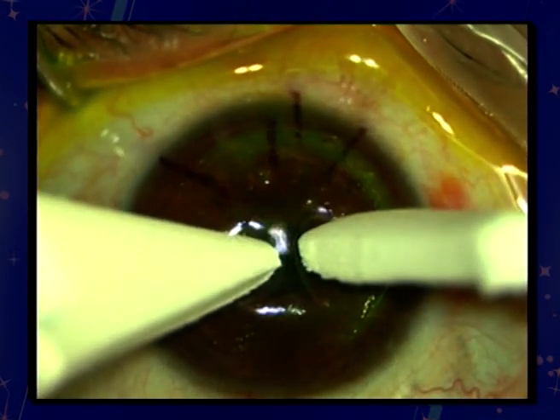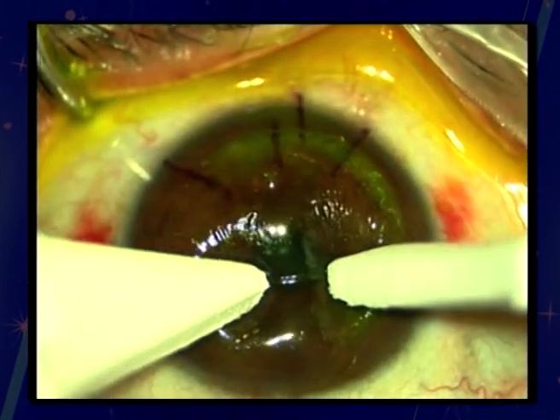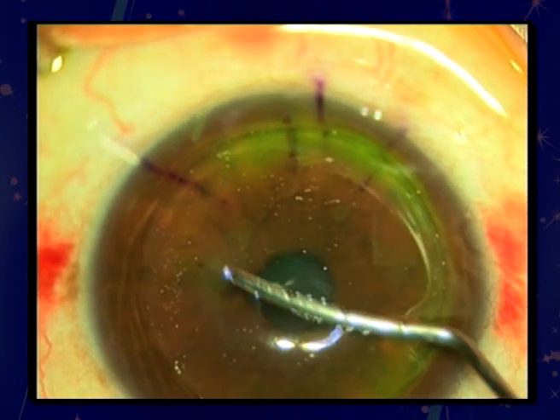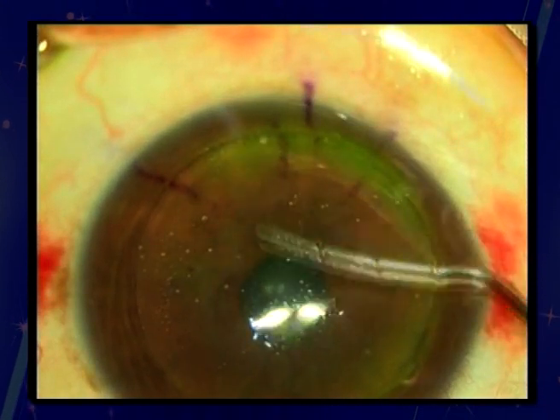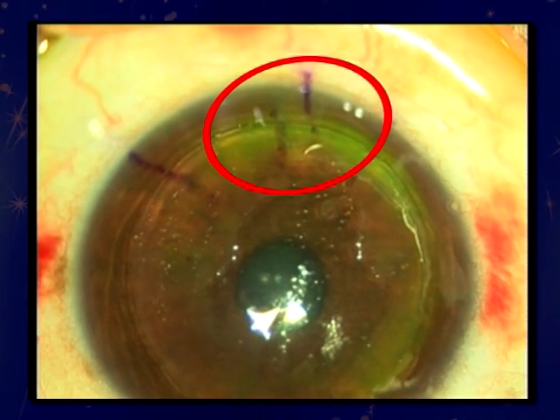The striae are stretched perpendicularly. The flap is replaced on the bed after thorough washing of the interface. The pre-placed marks show a significant shift after realignment of the flap.